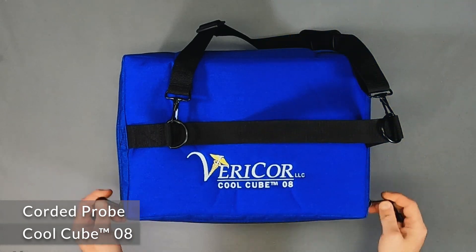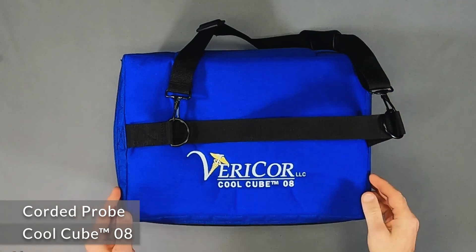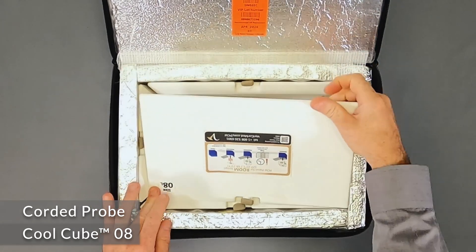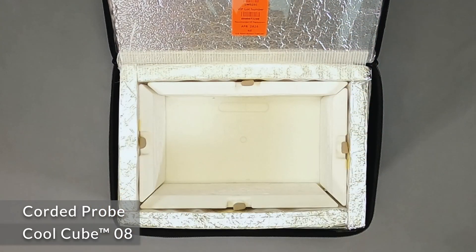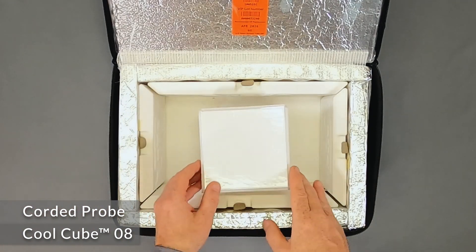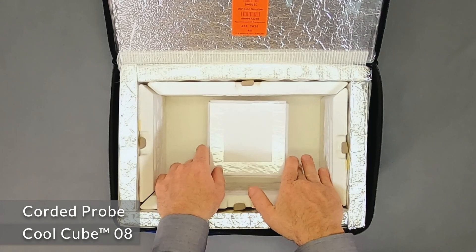Routing a corded probe through the CoolCube 08. The CoolCube 08 has clear plastic external pockets for holding a temperature monitor or other things during use. When using a device with a corded probe, here's how you can do it.